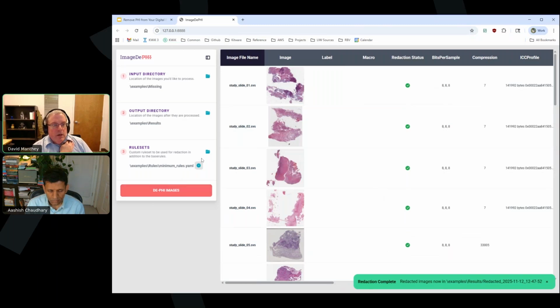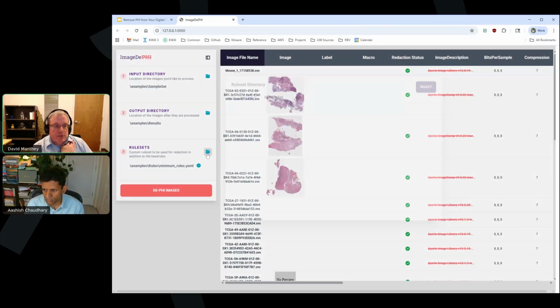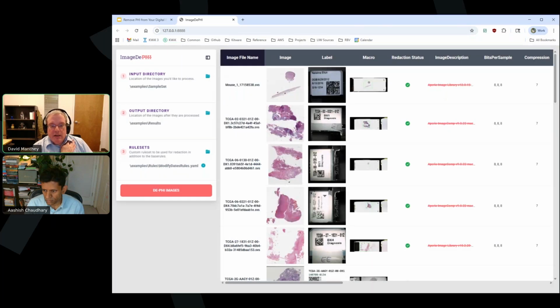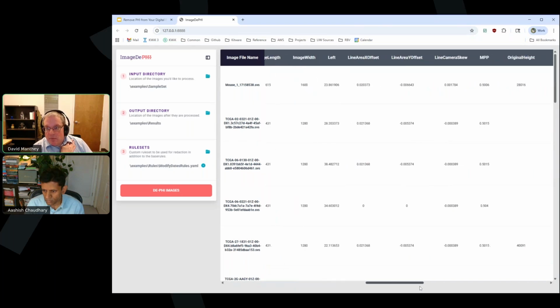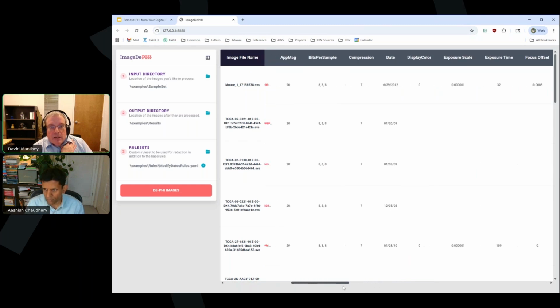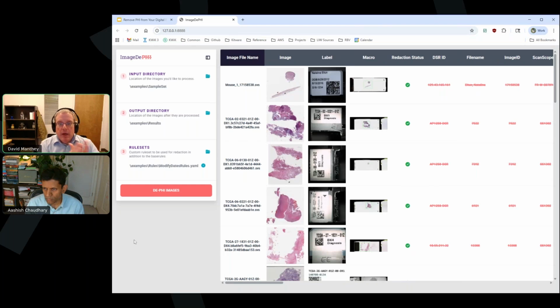And so again, if I wanted to choose something different, I could go back to my original set here and say, I'd like to use my date rule set, with the modified dates. So instead of getting rid of dates, it would actually keep my dates and round them to the nearest year. Somewhere in this column, I'll have the dates that are being modified. So it's showing the dates are not going to be removed, but they will be modified. And so you have these options.